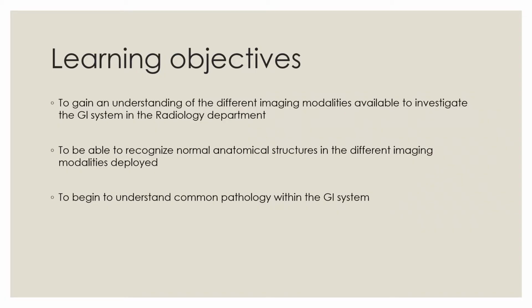I have three main learning objectives today. The first is to gain an understanding of the different imaging modalities available to investigate the GI system in the radiology department. The second is to be able to recognize normal anatomical structures in these different imaging modalities deployed. And the last is to begin to understand common pathology within the GI system.